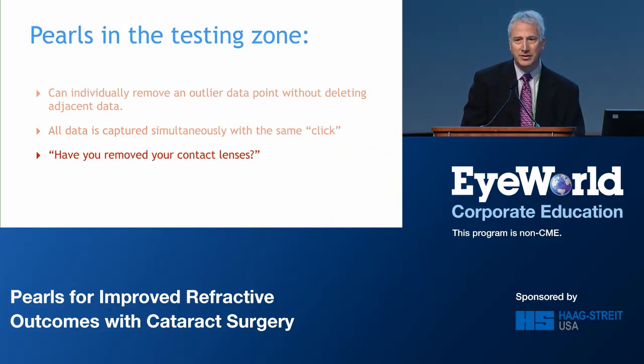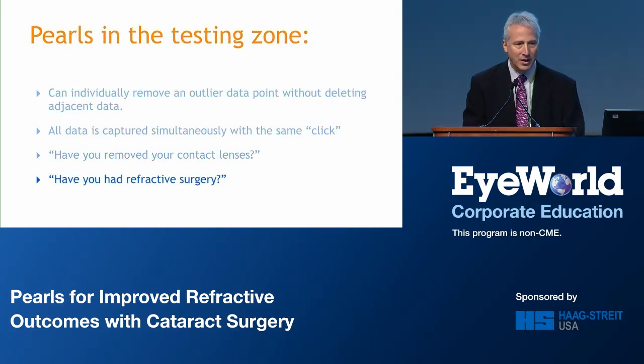We always like to mention in the testing zone, my team always asks the patient, have you removed your contact lenses prior to doing this study? Ask me why we ask that, right? Because many years ago, about 10, 15 years ago, we actually had a patient who had the front of their contact lens measured, and their refractive error was exactly the power of their contact lens. So there's just a little pearl that's not specific to Lenstar, but it's a really good thing to have in mind. We always have our techs ask the patients, have you had refractive surgery? And sometimes we say refractive correction because sometimes people don't know that it was actually surgery or don't think so.